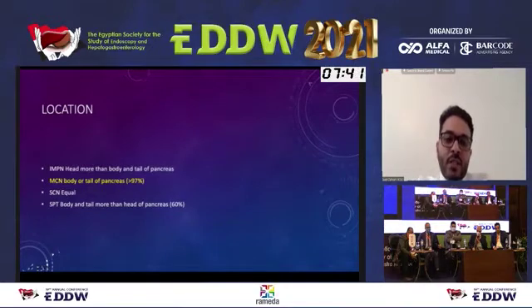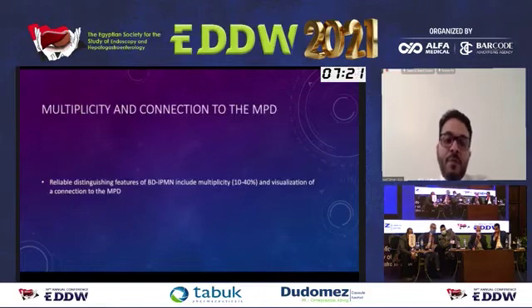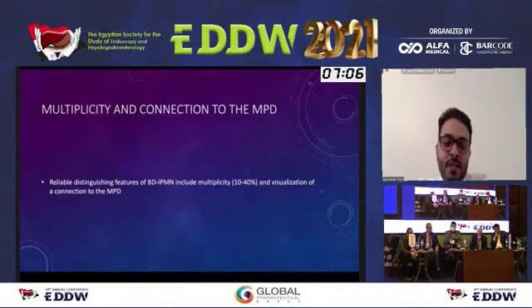You want to know the location of the cyst, especially with mucinous cystic neoplasm, because this is a disease of the distal pancreas. So mucinous cystic neoplasm is a disease of females. It happens in females more than 97% of the time, and affects the body and tail of the pancreas in more than 97% of the time. Multiplicity and communication with the main pancreatic duct is a very important feature. So if you see multiple cysts communicating with the main pancreatic duct, this is branch duct IPMN, and there is no other differential diagnosis except cystic changes secondary to pancreatitis.